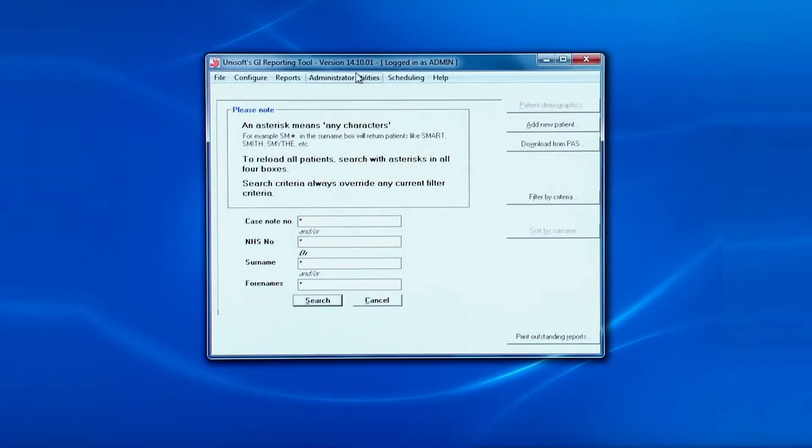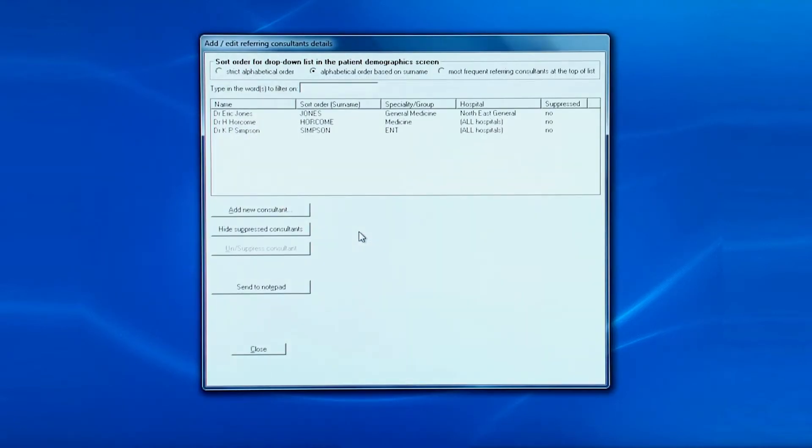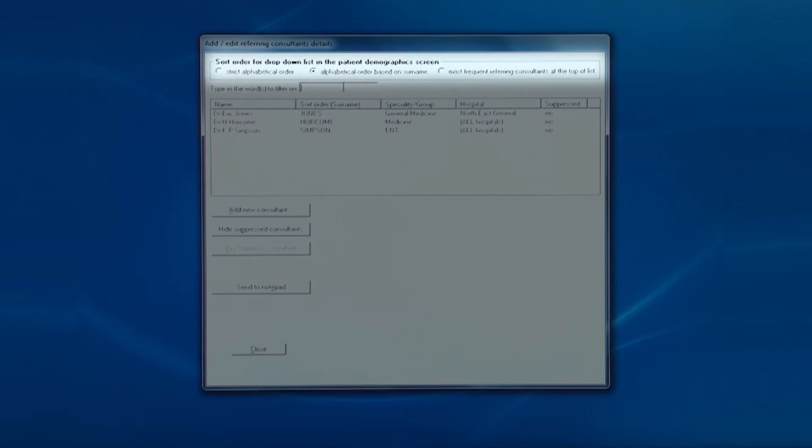Here you can see a few referring consultants. You see their specialty and which hospital they belong to. The first point to note is the top line. You can set the order by which you want the referring consultants to be displayed in the drop-down boxes on the patient demographic screen.